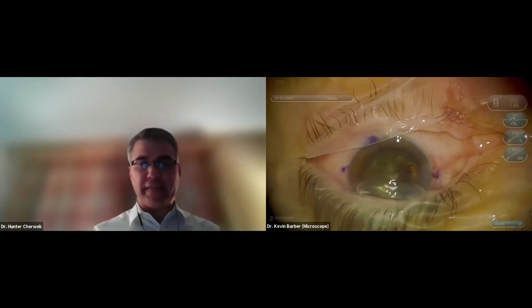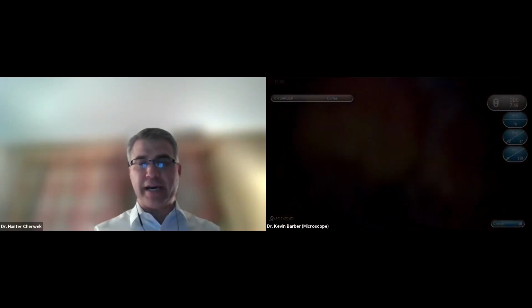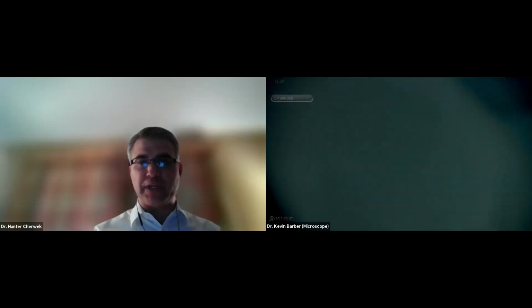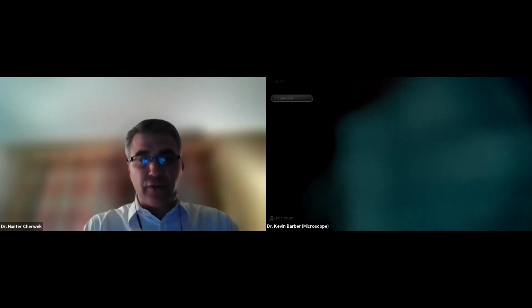I don't know if you have any teaching points before we jump into the interactive Q&A. Were there any other points that you encountered in that case that you'd like to highlight, or do you want to jump into some of the questions from the audience? Let's see, anything that you saw? No, I think the key is that you measured thrice and cut once, so you have confidence and clarity in your plan. And I think you did a great job with the OVD removal.